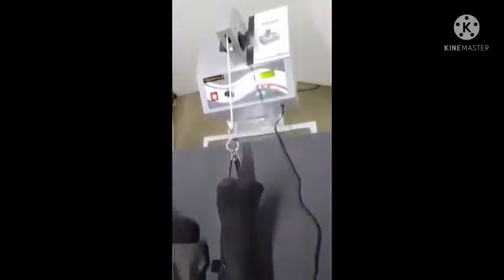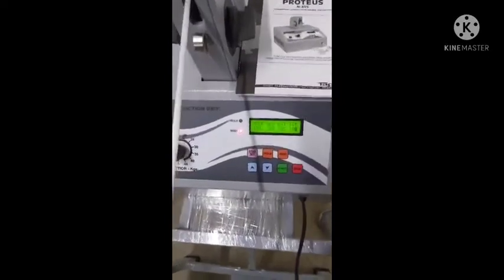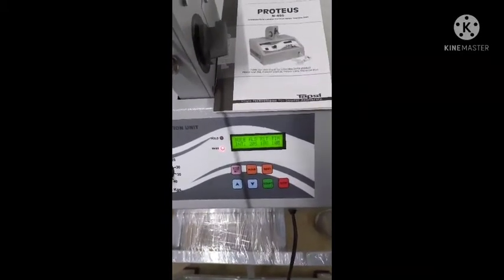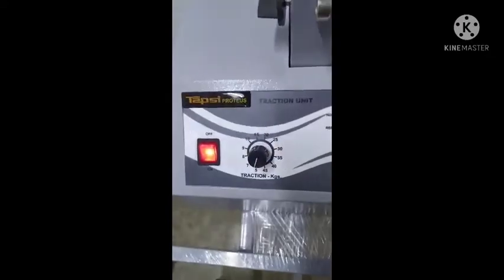So in any case of emergency, the patient can stop the treatment. Now it is a rest phase. And this knob is used to set traction force.